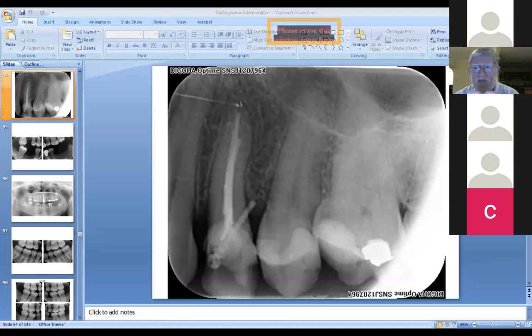Perfect, thank you. I've got a question from Delvin here. When you were mentioning about building the marginal ridge of the restoring tooth, of the opposing cusp, how can you assess this, especially if your bite wings could not capture that relationship?